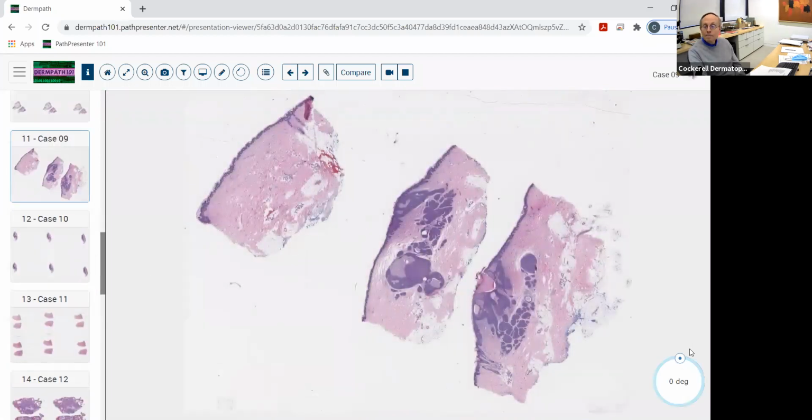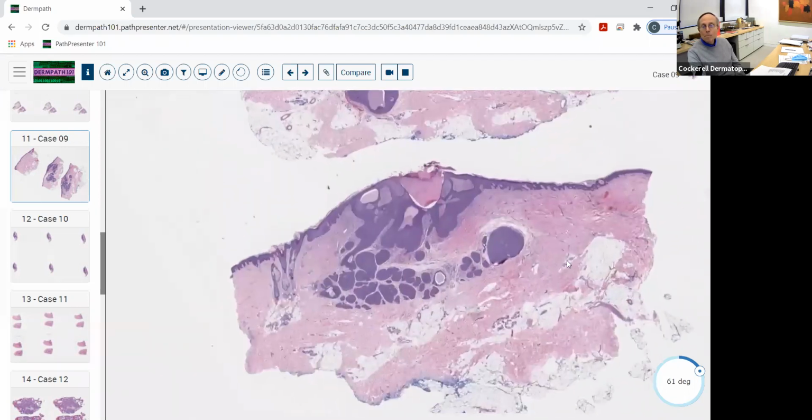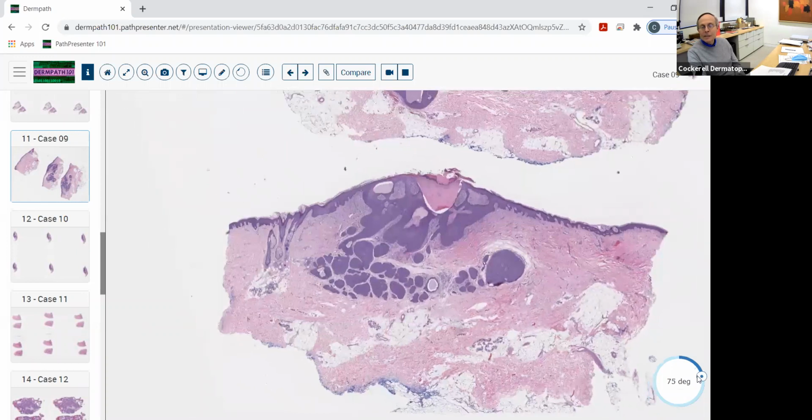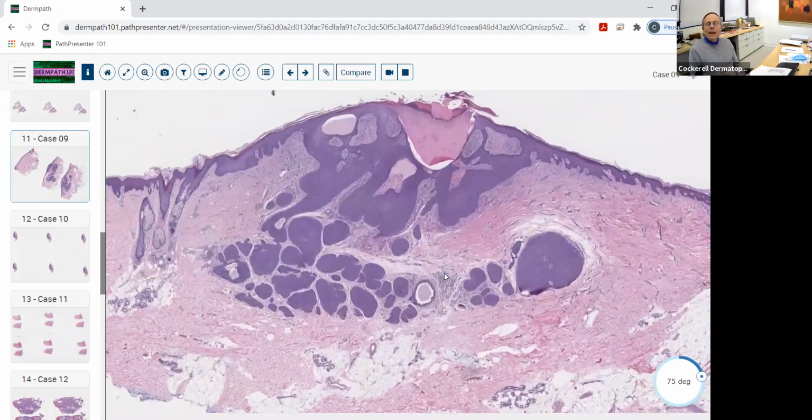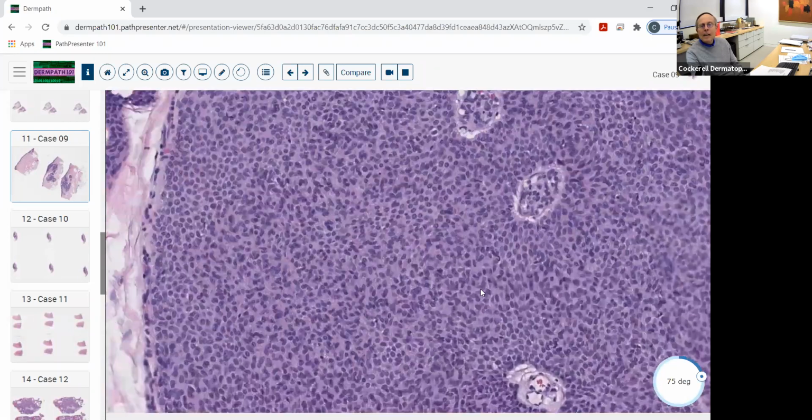Okay, this lesion, notice low magnification, excisional biopsy. It's got this contiguity with the epidermis. And so now we're looking at a spectrum. There's sort of three things, or four things, if you will, that can all give you the same type of epithelial differentiation. And this is a nice example because it shows a spectrum of all of them together. So if you look at high magnification and you look at these individual cells, they look very, very monomorphous.